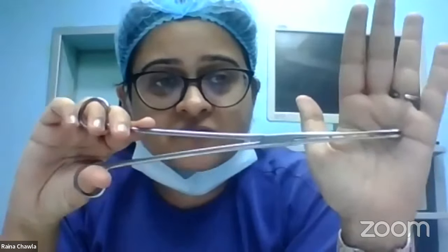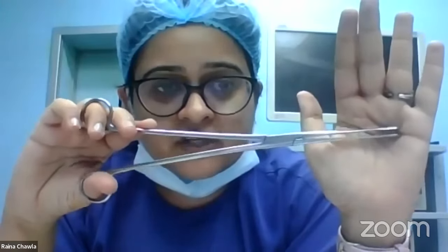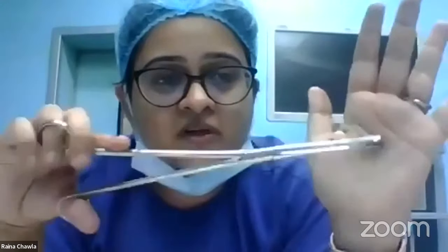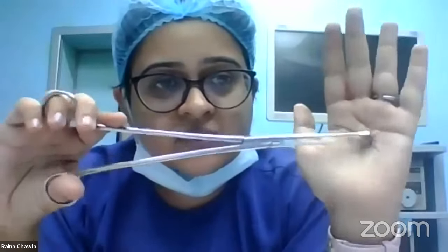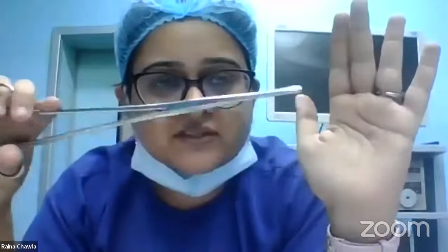Trauma is very important. So what happens if inadvertently I catch a bit of tissue, say this my palm is, I catch a tissue like here and it has a lock and I lock it, I will end up damaging the uterus, or the uterine tissue. So it doesn't have a lock. So even if I inadvertently catch it, it'll let go. This is why it doesn't have a lock, because after all, it's a blind procedure. I don't know what is inside. I don't know what I'm catching. I'm trying to catch the products. I may catch the tissue here. And if I lock it, imagine my whole skin will get crushed. That's what will happen to the endometrium and the underlying myometrium. So that's why it doesn't have a lock, so that we just catch whatever's there and take it out.